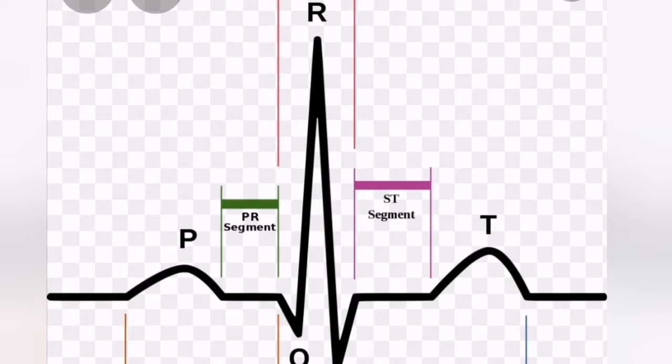And in ventricular fibrillation, you can find there is an abnormal shape for the QRS, or there is no QRS complex, and because there is no conduction for cardiac output, usually you will not find a pulse.